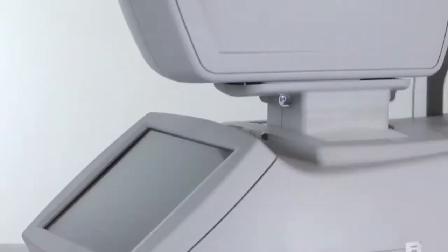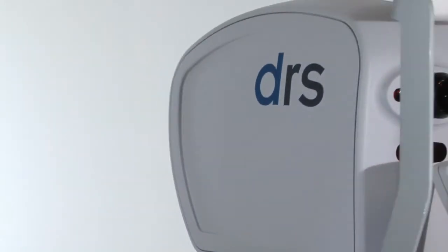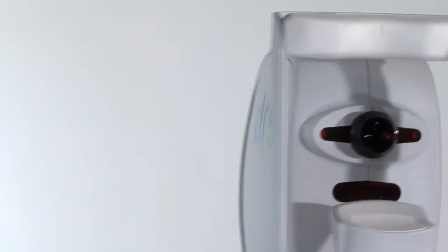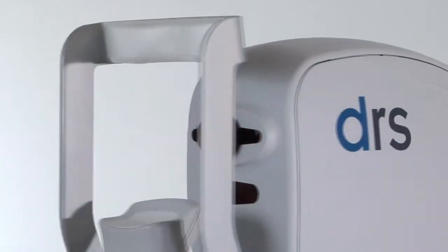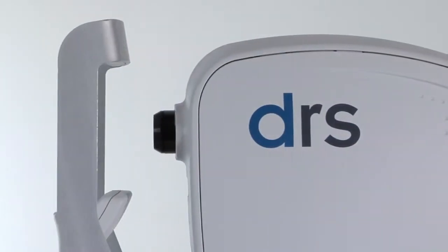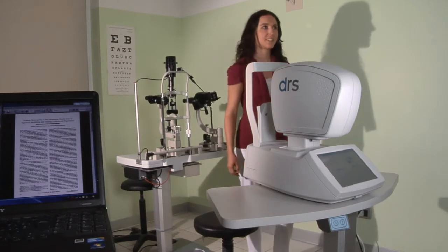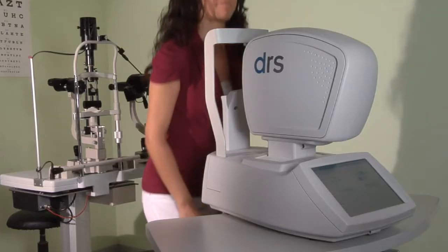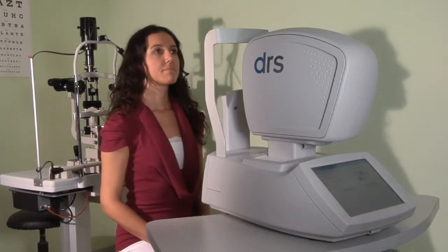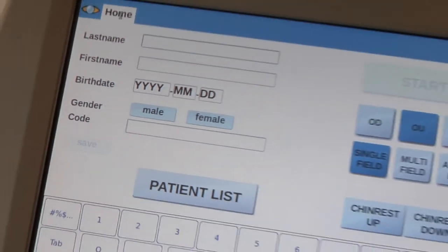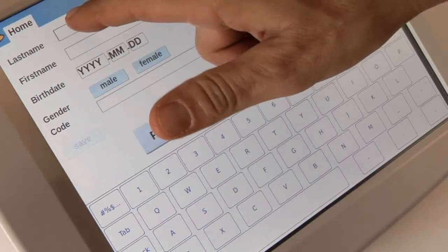The DRS is a non-mydriatic retinal camera that is fully automated. Conceived to maximize patient flow, the DRS allows for large-scale screening programs, which are key in the prevention of diabetes-induced vision impairments that can lead to blindness.